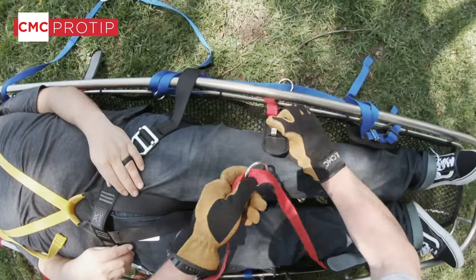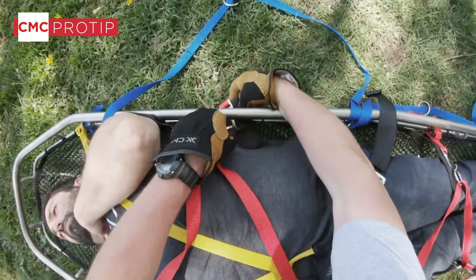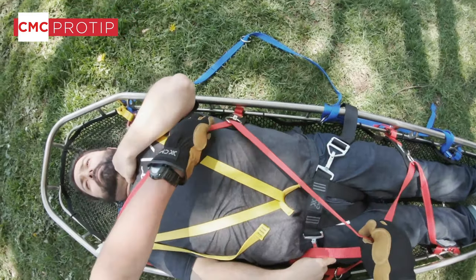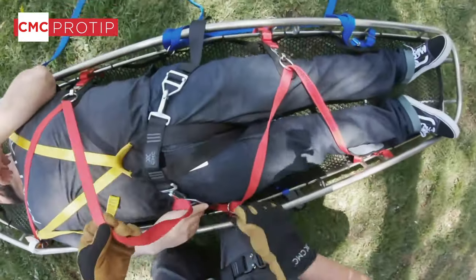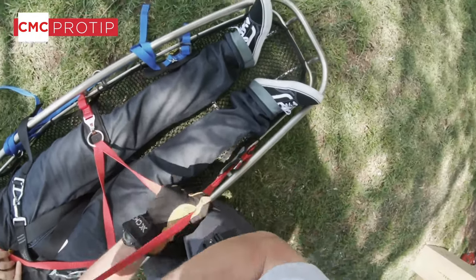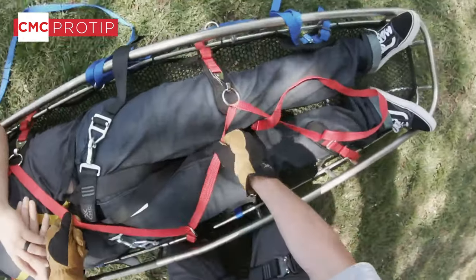Now we're going to connect in our cross straps. You need to make a choice here — if we have a compliant patient like Kevin we can leave his arms out; if he was combative or unconscious we may want to put his arms in. We make sure the padding is towards him and start working the slack down, then take the slack out and snug it up. The excess webbing simply goes between his feet.